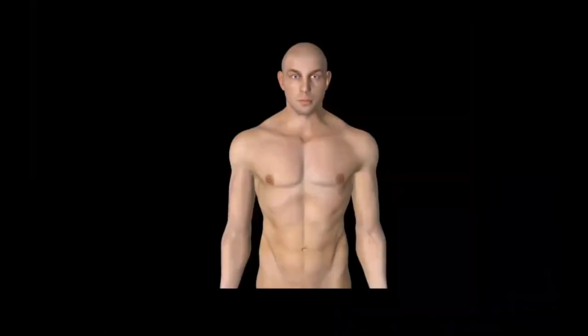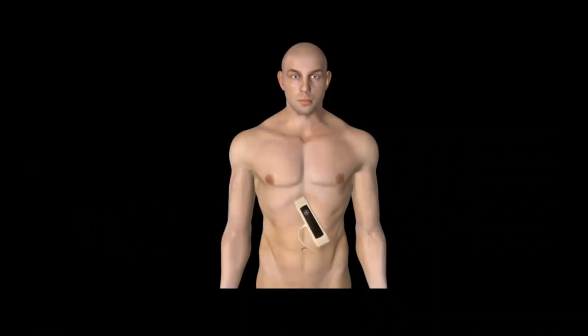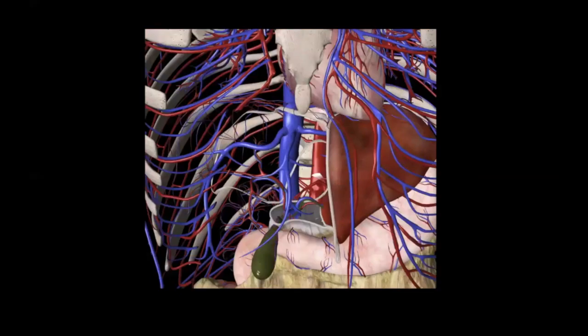So if we take our average patient and we take our phased array probe, for example, place it into a modified subcostal zone, we're wanting to focus in on the liver and obviously the hepatic vein and the portal venous system. If we strip things down, an anatomical view will show us these structures underlying.